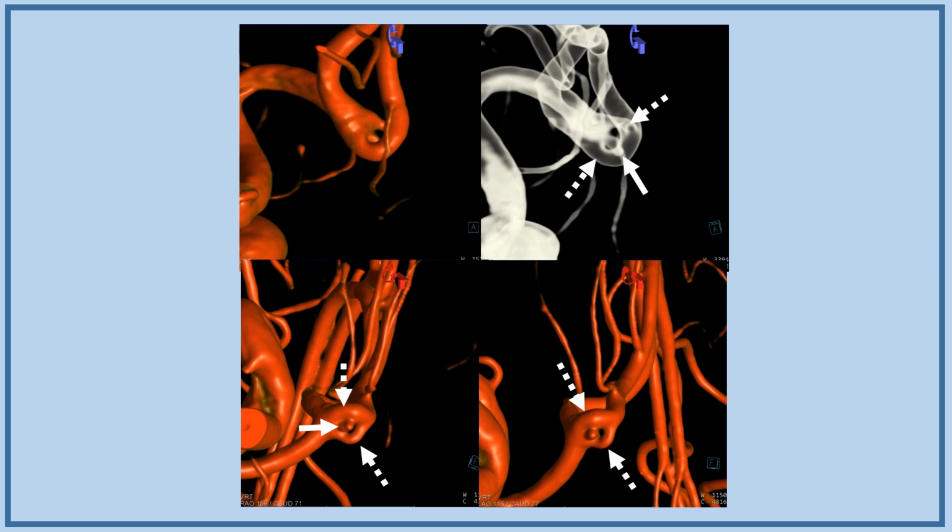interesting now. We see a small aneurysm delineated by the solid white arrow, and around it we see what looks like a fenestration of the anterior communicating artery complex. Not an uncommon situation. Now this fenestration is associated with a dominant right A1 segment. The left A1 segment is atretic, and so we have a fenestration, both limbs of which are supplying the left A2. And in between the fenestration, along the vector of the flow, as is typically the case, we see a very small aneurysm measuring about 0.7 by 1.5 millimeters, based on both 3D and digital subtraction measurements.